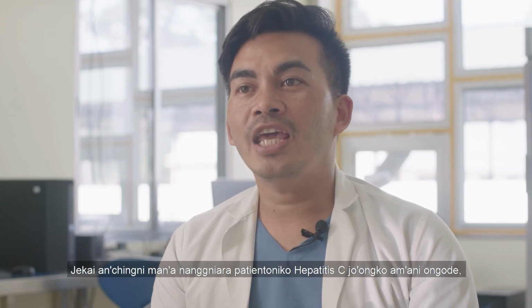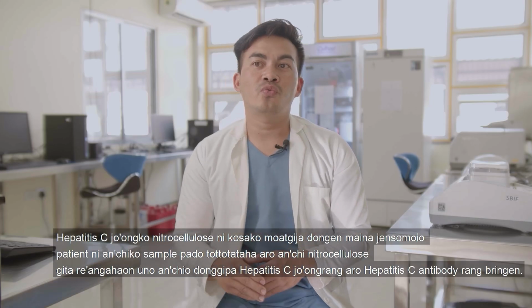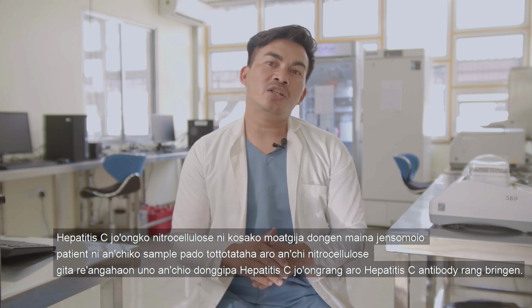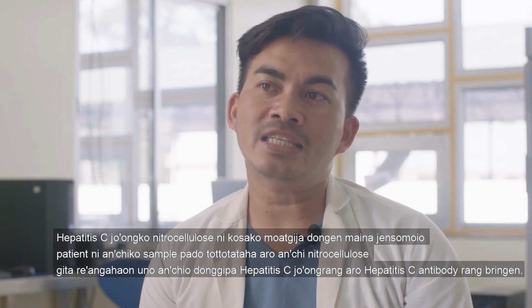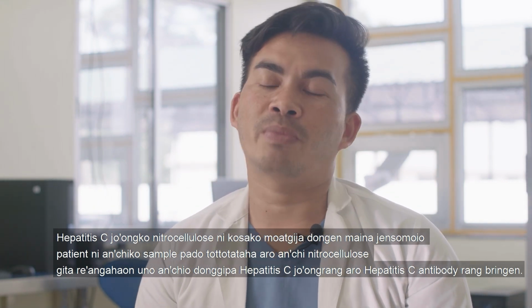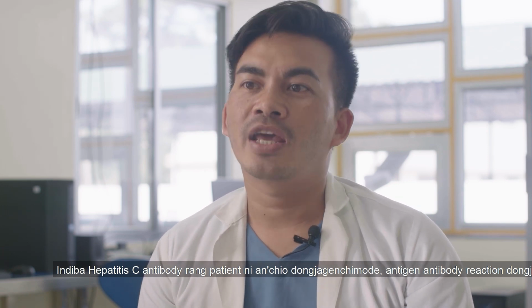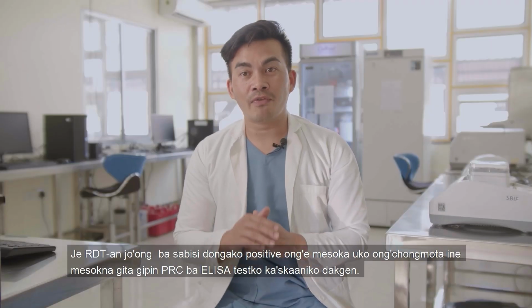For example, if the aim is to detect hepatitis C antibodies in the patients, then hepatitis C antigen will be immobilized over the nitrocellulose membrane, so that when the patient's blood is added to the sample pad of the device, there will occur interaction and binding of the hepatitis C specific antibodies in the patient's blood and the hepatitis C specific antigens as the blood passes over the nitrocellulose membrane. The RDT will flag positive for such a sample. If there are no hepatitis C specific antibodies in the patient's blood, there will be no antigen antibody reaction. Thus, the RDT will show no reaction and flag negative.